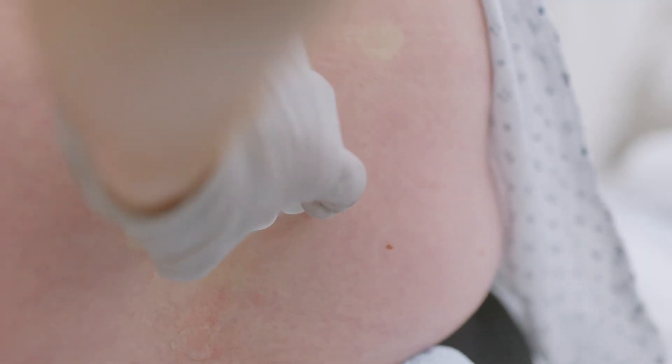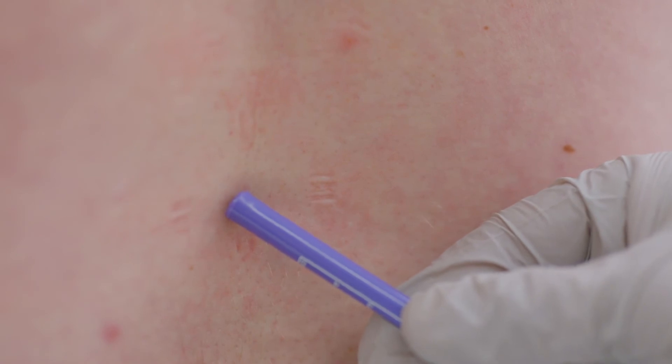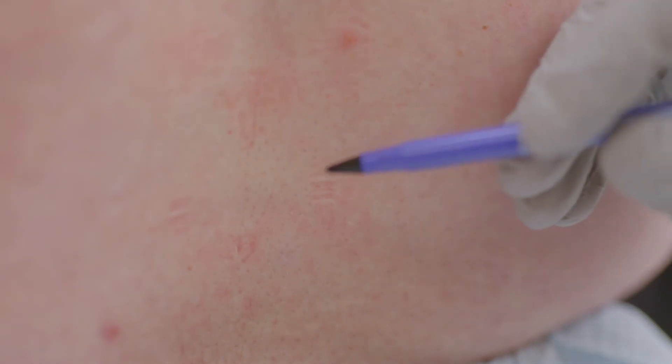Press the locator guide into the patient's skin. The pressure should leave four indented markings on the skin. The center of the locator marks is the needle entry point.